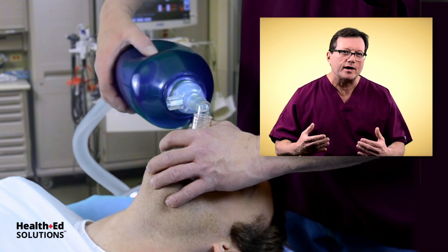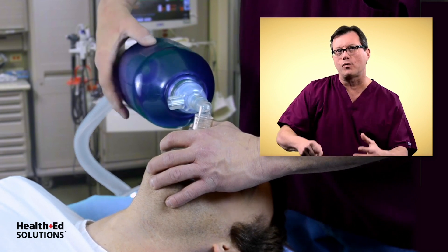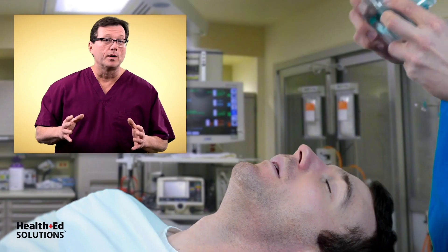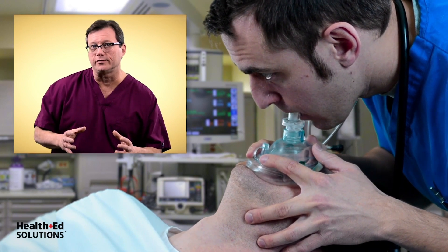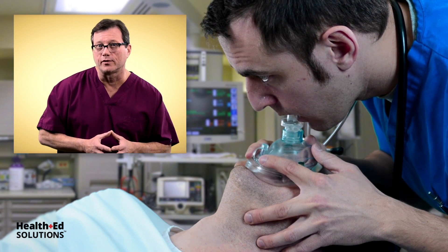If the patient takes a spontaneous breath, I'll feel that and I can support it. Remember, keep a little pressure on the ambu bag with your thumb. Now, if you don't have a bag valve mask device to provide ventilations, you can still do this with a barrier device — you can still provide mouth ventilations. A mask with a filter and a one-way valve would be preferred.